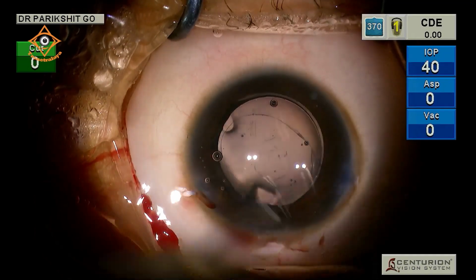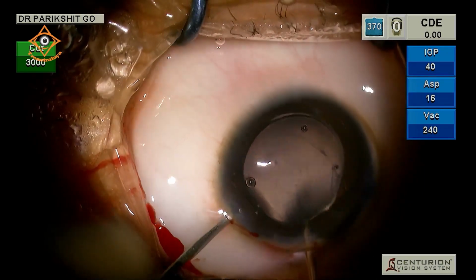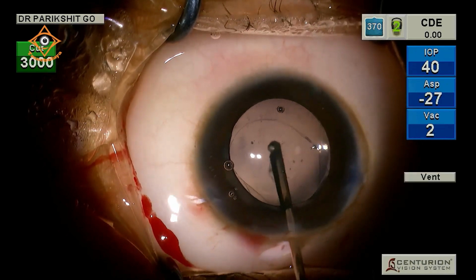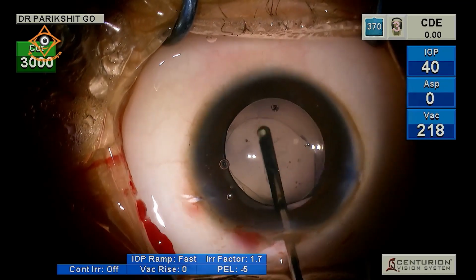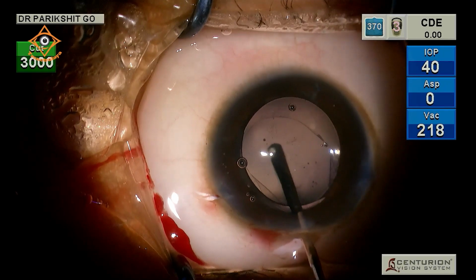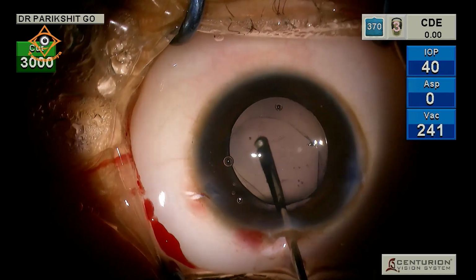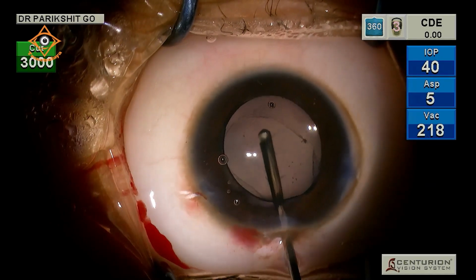Yes, but that's what we have, based on my setup and skill and everything. But as long as, I said, you can do many things, whatever you want to do. That's okay. And here also, the vitrectomy can be done through different approaches and different ways. But if you're doing one way all the time, you know the limitations of that and the advantages of that. So I think Parikshit is showing one option, which he's showing so well, actually.